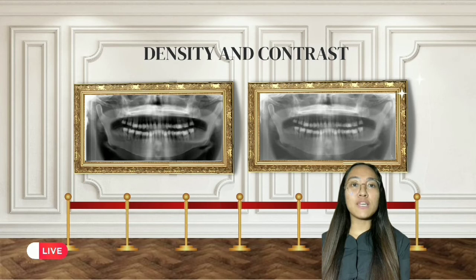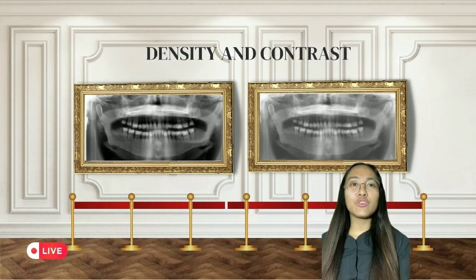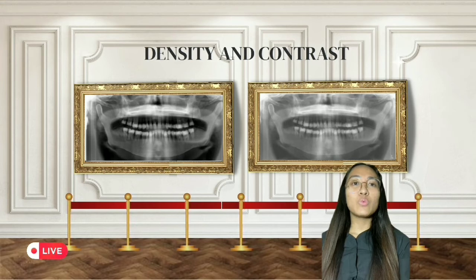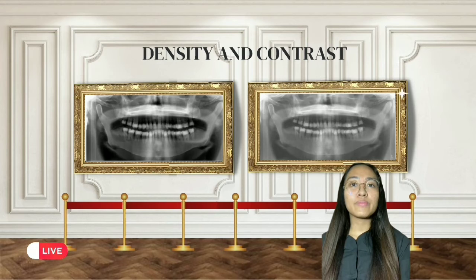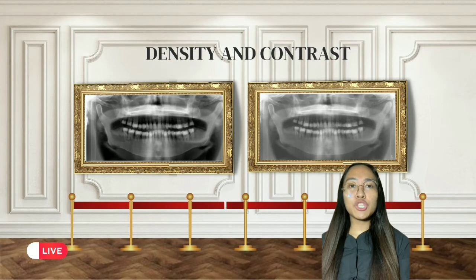With an ideal panoramic image, the density or overall darkness is not excessive. An overexposed image, which is the image on the left, appears excessively dark with areas of burnout. On the other hand, an underexposed image, which is the image on the right, appears excessively light with areas of whiteout. An overexposed or underexposed panoramic image may cause problems with detection of unerupted teeth or bony lesions. It is important to note that with digital imaging, an overexposed image can be corrected with the use of software, but an underexposed image cannot.